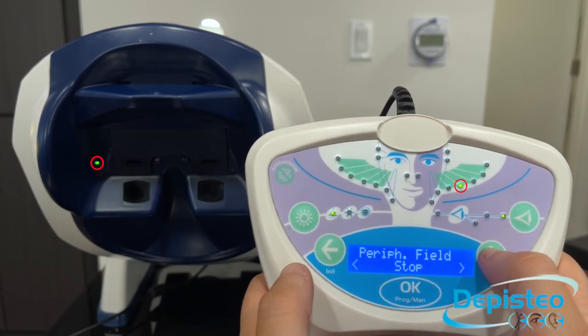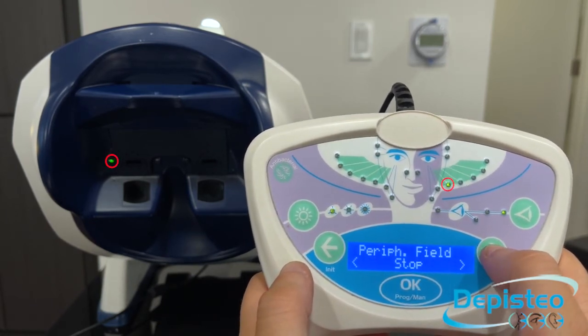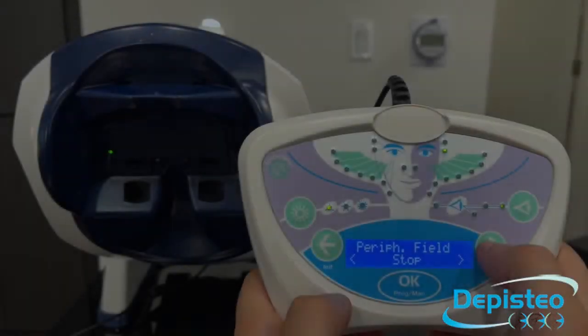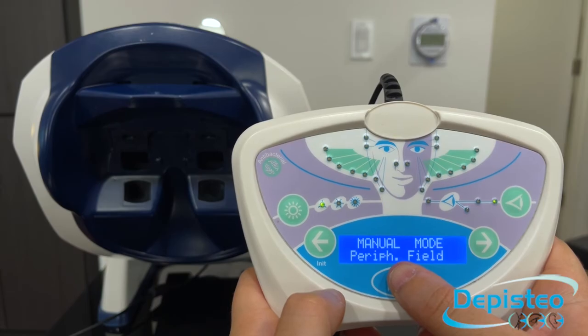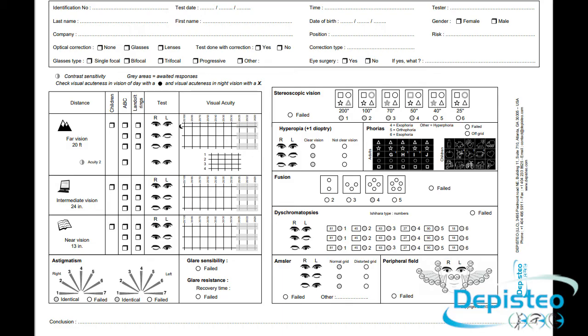And you can adjust it with the left and right arrows. Once you are done with the peripheral test, you can click on OK to exit it. And finally, you can record your results on the response form.